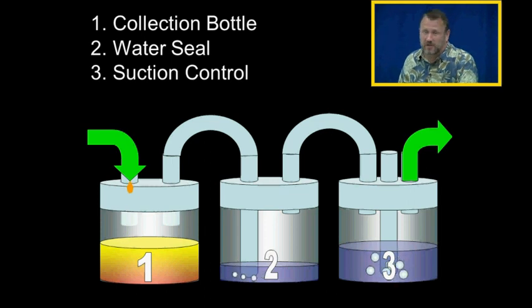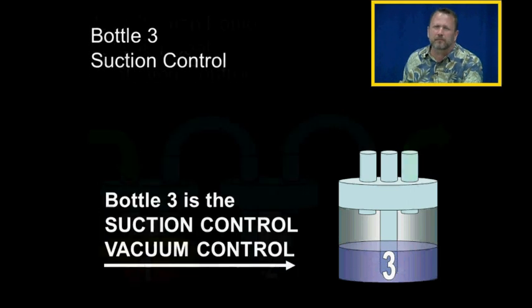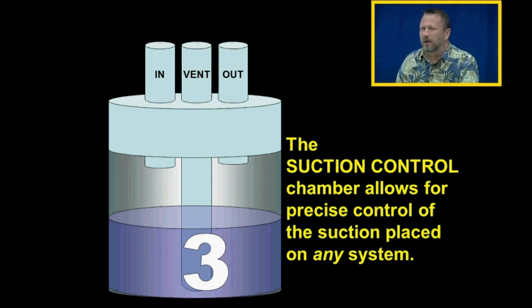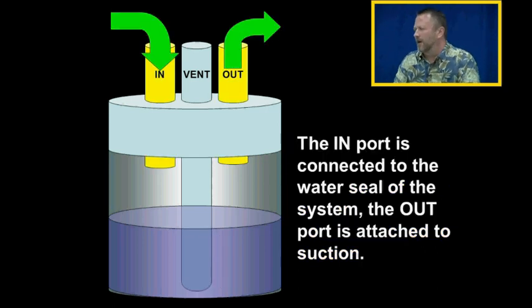Let's talk about the suction control. Bottle three is the suction control, otherwise known as the vacuum control. The suction control chamber allows for precise control of the suction or vacuum placed on any system. The input is connected to the water seal of the chest tube system. The output is connected to the suction device.